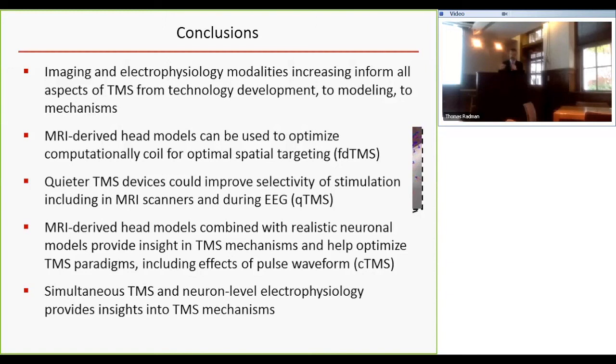For example, we normalize the stimulation for one pulse, and then we look at the differences for the other pulses, which is equivalent to looking at ratios. Sure, but you're comparing to the published normative data, right? You're not looking at each individual MRI and then reconstructing that and then looking at that ratio for that. Okay, yes, no. Okay. Right. We're not looking at individual MRIs.